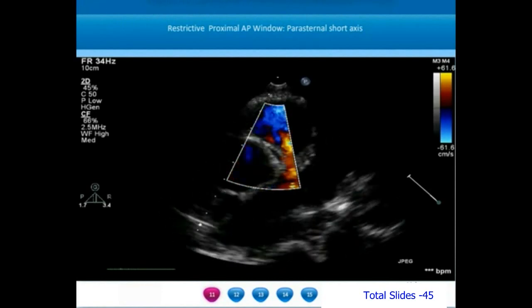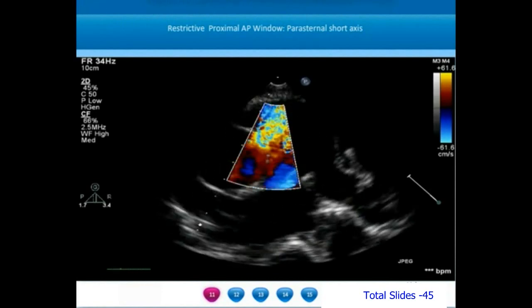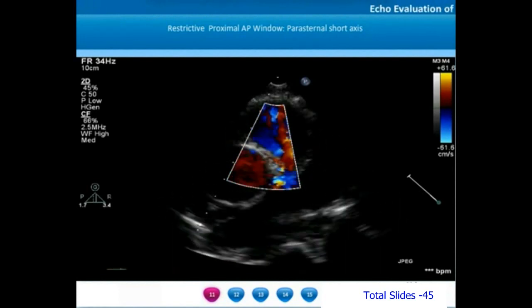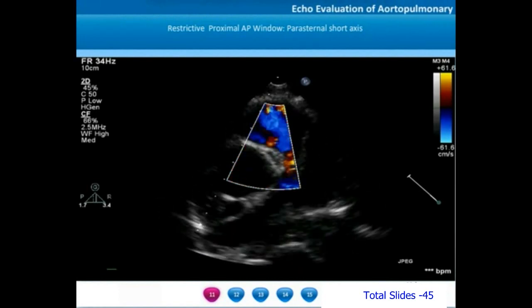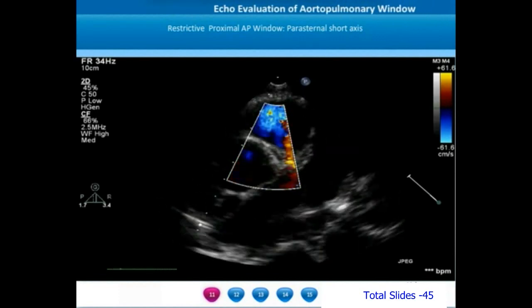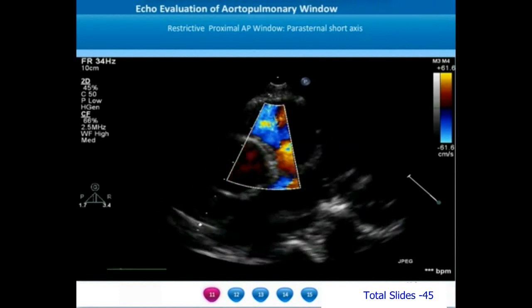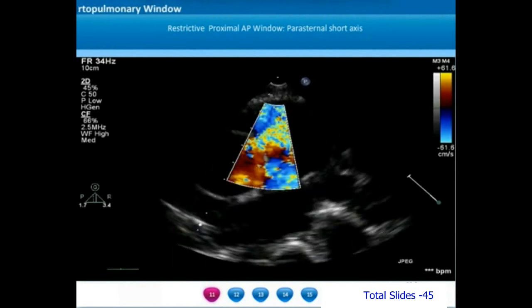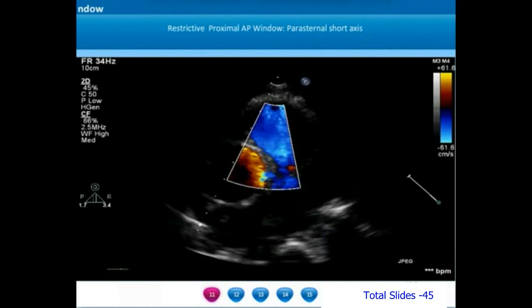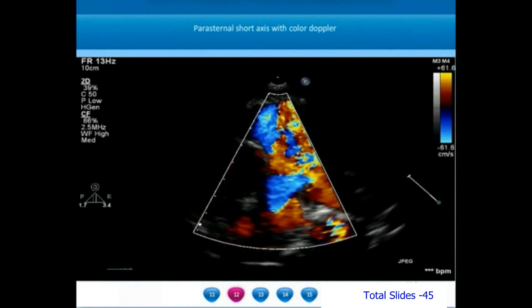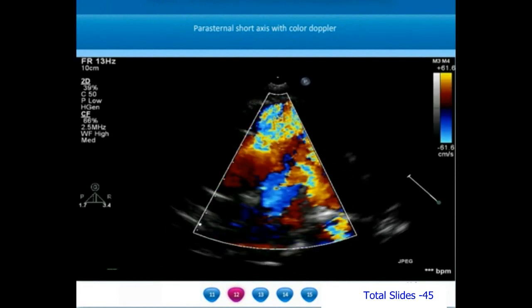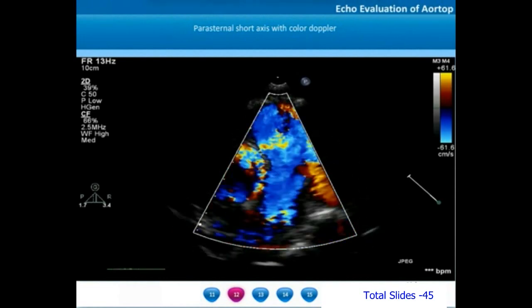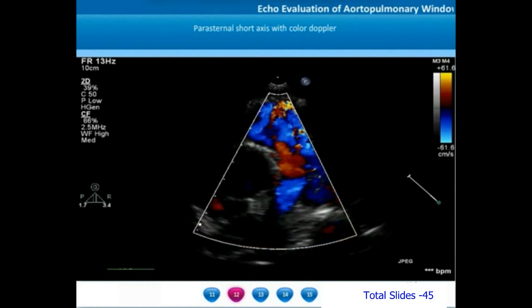Proximal AP windows are AP windows which are very close to the semilunar valves. This proximal AP window is restrictive because there is turbulence in the color flow between the ascending aorta and the main pulmonary artery. When we magnify that view, we are able to appreciate a moderate-sized proximal aortopulmonary window with abundant left-to-right shunt.